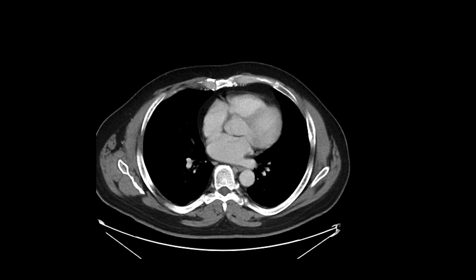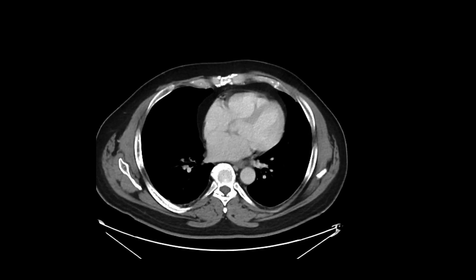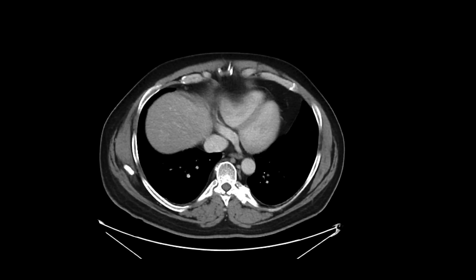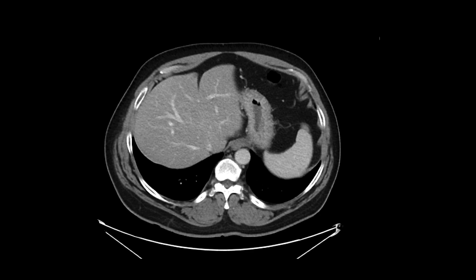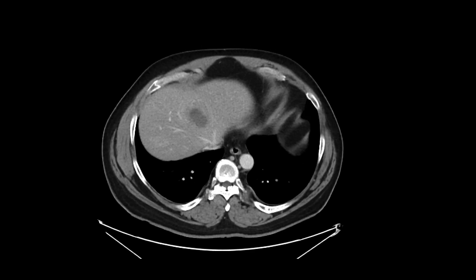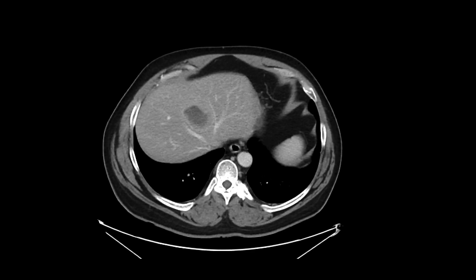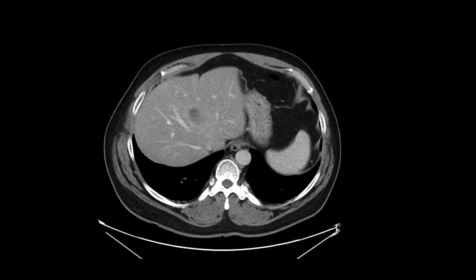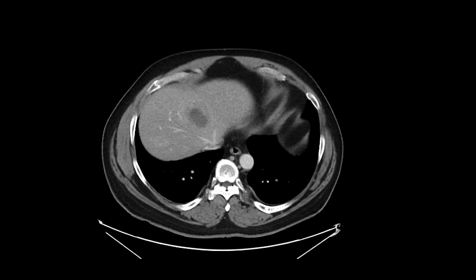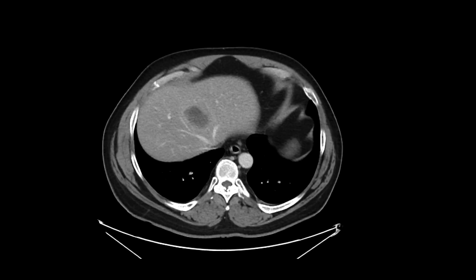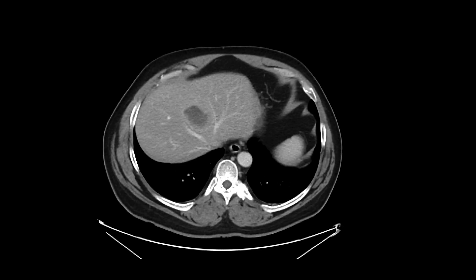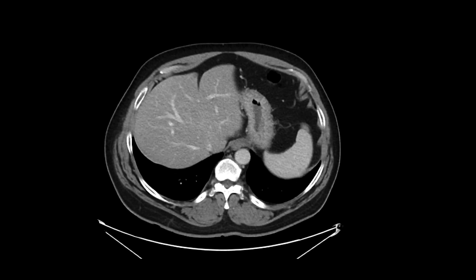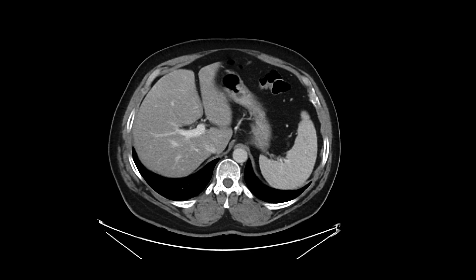This is a patient who comes in with abdominal pain. We had a CT scan of the abdomen and pelvis. As we scroll downwards, we immediately see that there's a low-density mass in the liver. That may well represent a neoplasm — it could also be an abscess — but there's not a lot of inflammatory change, and so we certainly should be worried about an underlying metastatic lesion at the very least, or a primary malignancy.